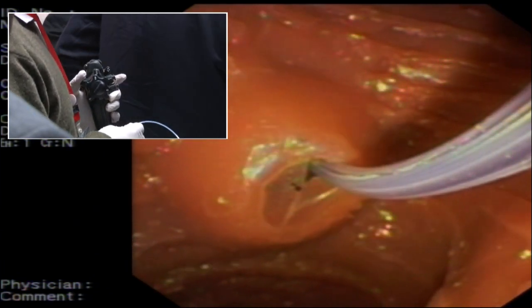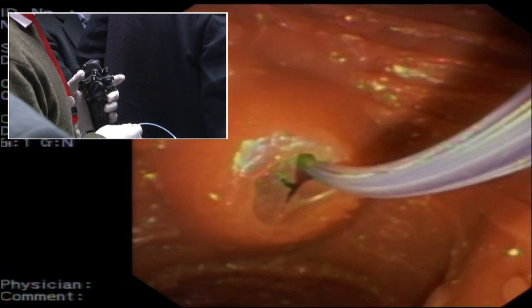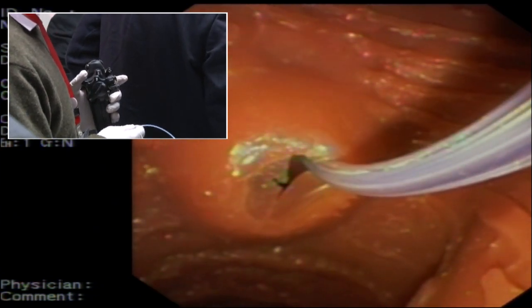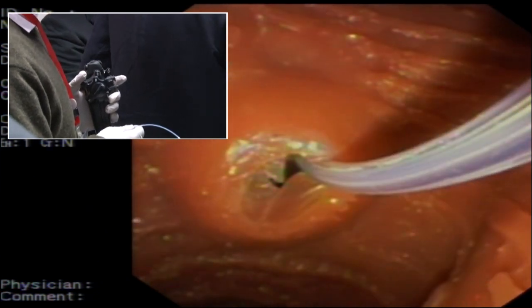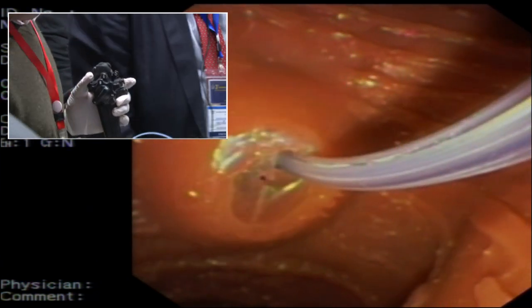For what you do is, इसको force से भी पकड़ के ना. No, you need to pass a wire. हाँ वही जो, वो वायर है नहीं.